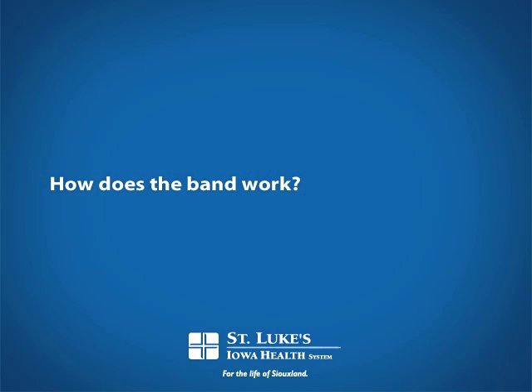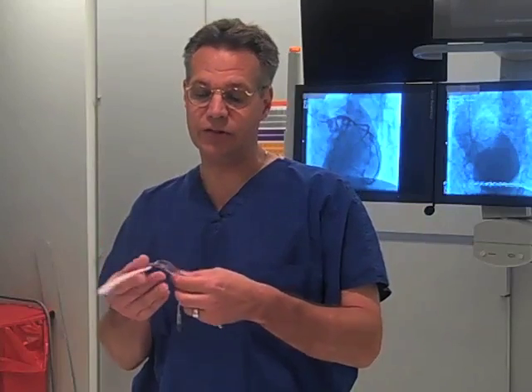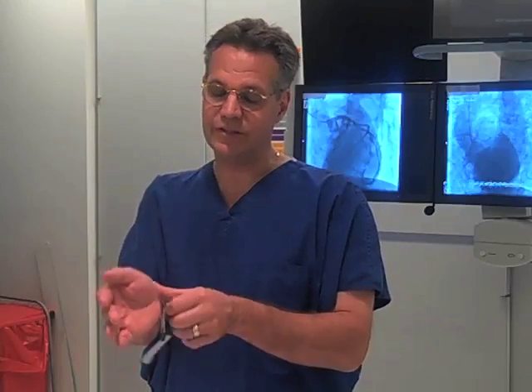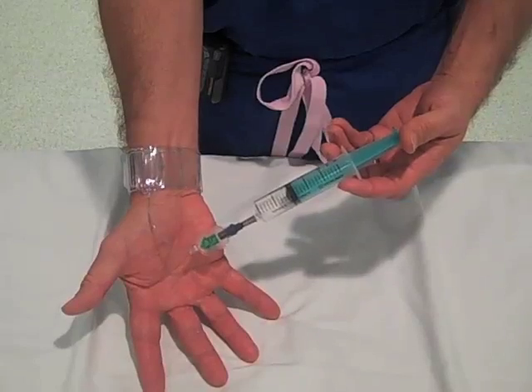You have a band there. Kind of explain to us a little bit how that works. Sure. This is just one of many different techniques that are used. This particular band is clear, so it allows you to see when the procedure is done and there's a catheter in place. This is simply affixed over the artery at the puncture site, and then air is instilled in a bladder.